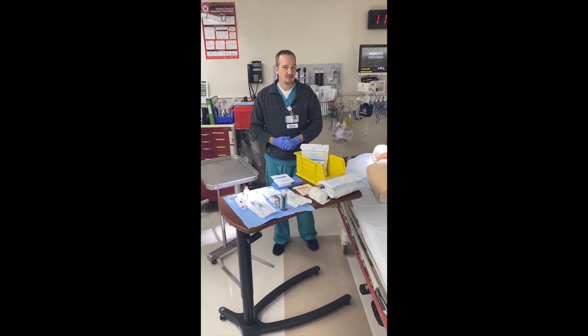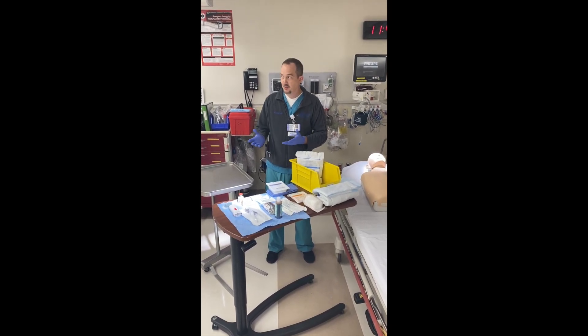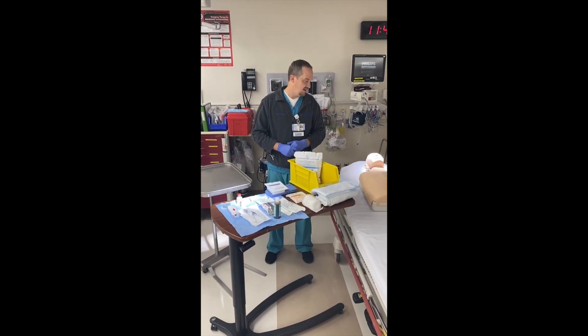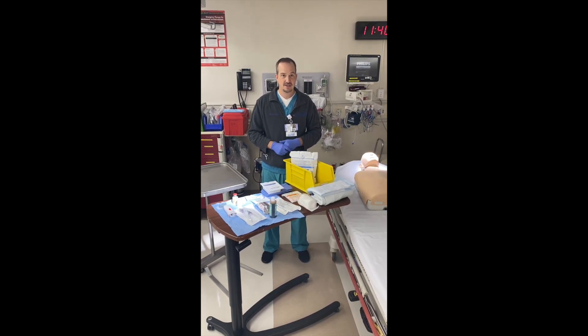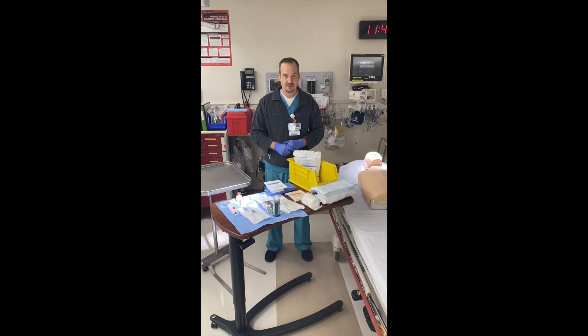We're here today to go through the proper setup and the tools needed for an EVD, an external ventricular drain. A lot of times people will come into the trauma bay and they could have hydrocephalus or a massive bleed where we have to put a ventricular drain in to divert the cerebrospinal fluid.